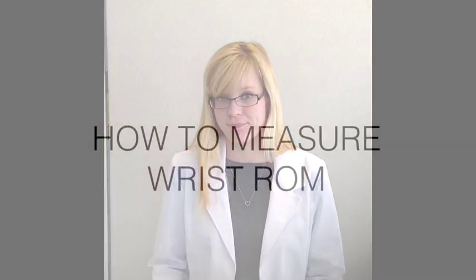All right, there are several indications and contraindications for measuring wrist flexion. In terms of indications, if you suspect stiffness in the wrist joint, or if you think that that range of motion deficit is going to lead to later disability, you want to measure that. In terms of contraindications, you don't want to measure wrist flexion in your patients if they've had a dislocation in that area, or if they have had an unhealed fracture, if they have osteoporosis, or if they've just had surgery.